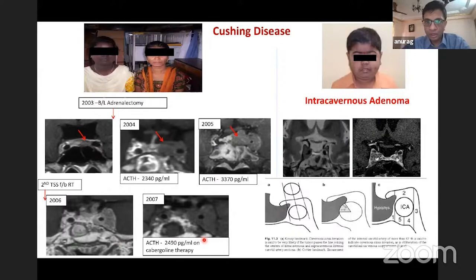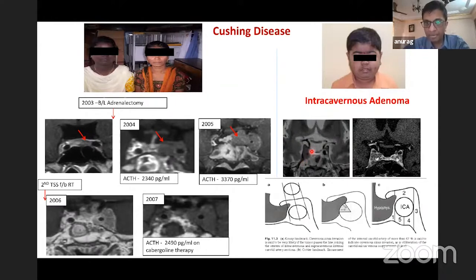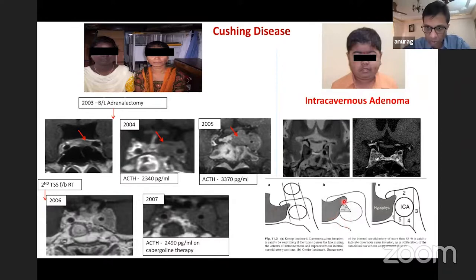This childhood Cushing's case was important because the tumor was directed around the internal cavernous part of the carotid. The surgeon felt the area was too difficult for safe surgery, so the boy was treated with primary radiotherapy and responded very well. For students: cavernous sinus invasion is suspected if the tumor crosses the central line laterally, if more than 67% of the circumference is involved, or if there is inferior invasion.